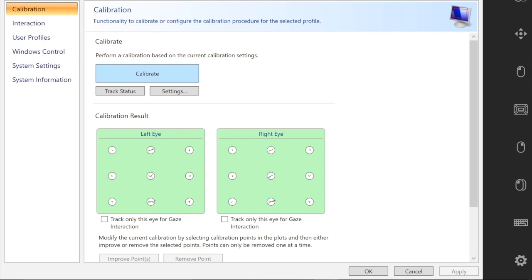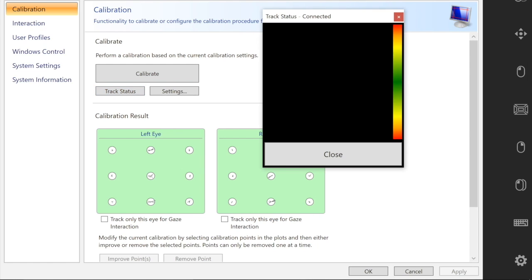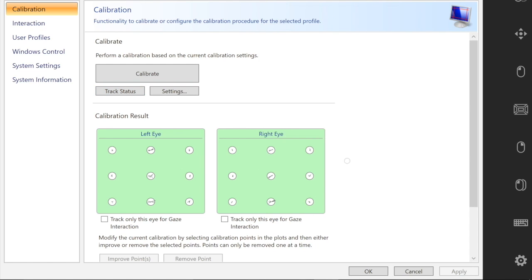The first thing I'm going to do is select the track status icon. This will help me position myself in front of the eye tracker. Now I'm going to select calibrate again. It will bring up track status. The idea is to get your two white dots inside the black box.